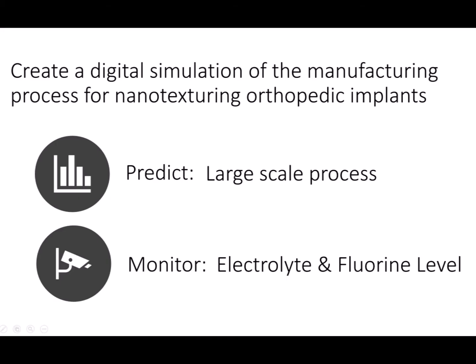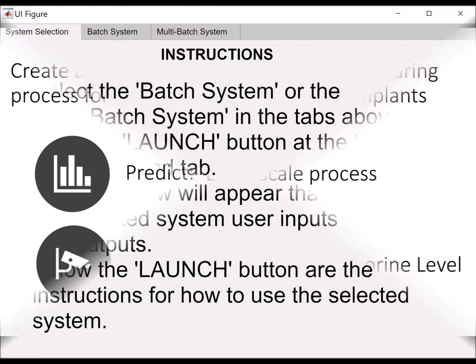Our goal is to develop a digital way of presenting the nanotexturing manufacturing process to potential orthopedic companies to bring to large-scale manufacturing. This digital simulation must be simple. Any operator should be able to reason one's way through. It will show how the process will potentially work with a focus on how long implants need to stay in the solution and how often the various chemicals deplete.